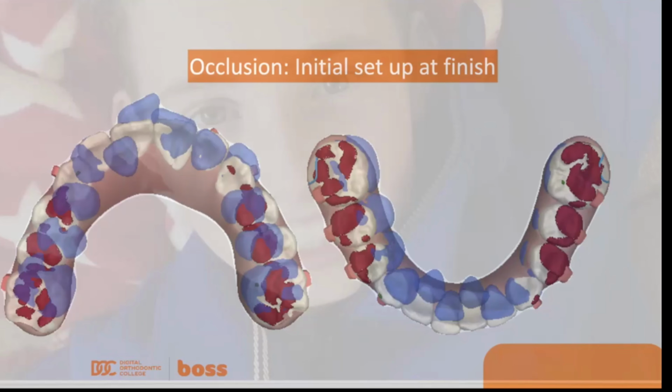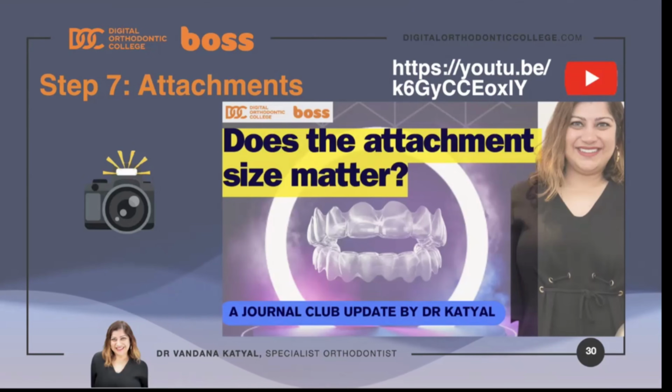Now, this is for a growing child where we're doing a lot of extrusion of the posterior teeth and using the dental alveolus development, vertical development to correct the deep bite. Once we've decided all those steps, we're now starting to think about attachments. I suggest that you think of attachments at the end because now you've set your goals. You know which teeth are intruding, extruding, which ones are being maintained, what are the changes you're after. Now we're going to design the appropriate attachments to create those movements.